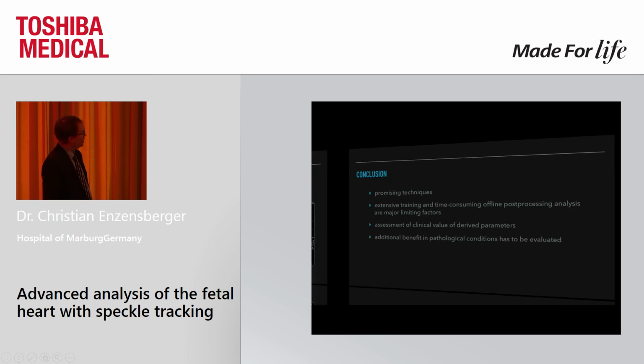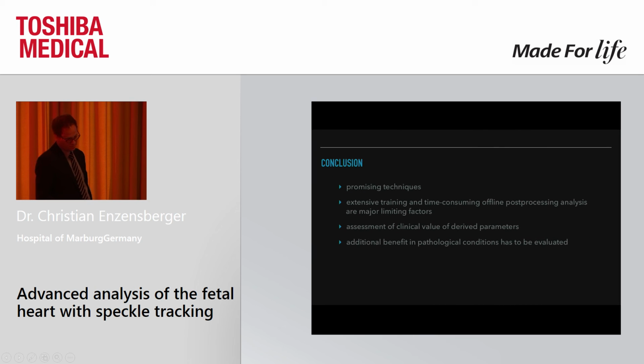Now, just to conclude, this speckle tracking is definitely a promising technique, but one of the problems we have to deal with at the moment is the extensive training and time-consuming analysis, which is not online, but post-processing analysis.